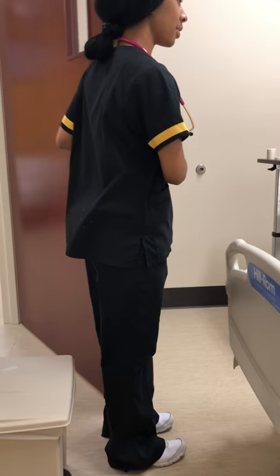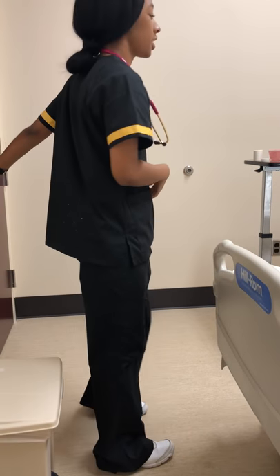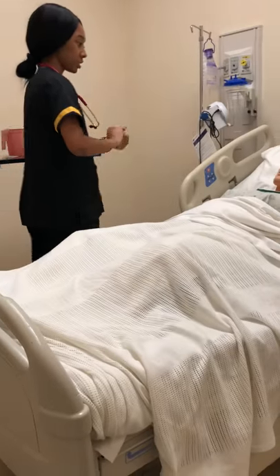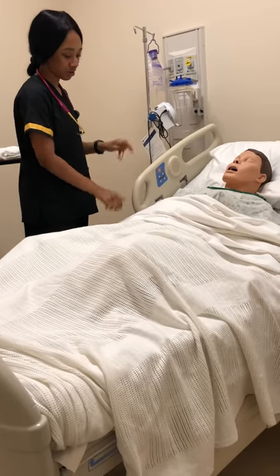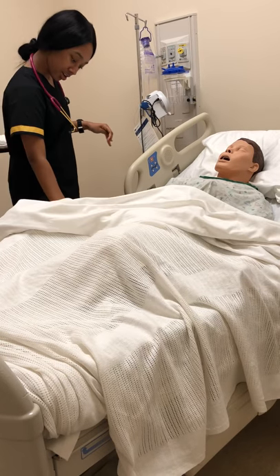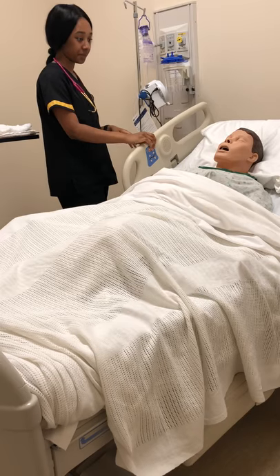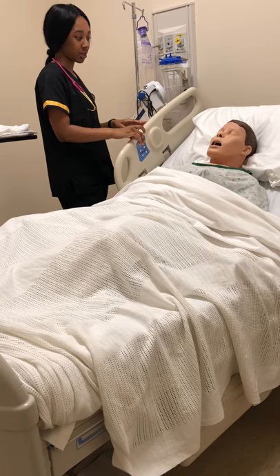Hey, how are you? My name is Amber and I'm going to be your nurse today. Your doctor ordered you to get a nasogastric tube, and I'm just going to confirm that order by having you state your first and last name for me and also your date of birth. All right, Ms. Johnson, do you have any allergies or anything like that? No? Okay, that's great.